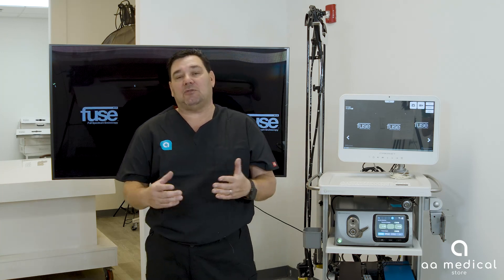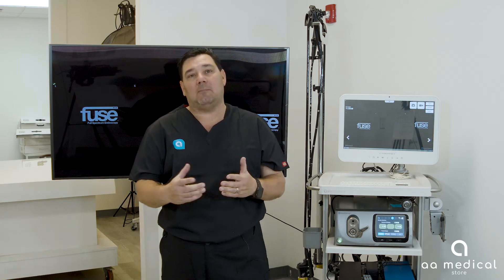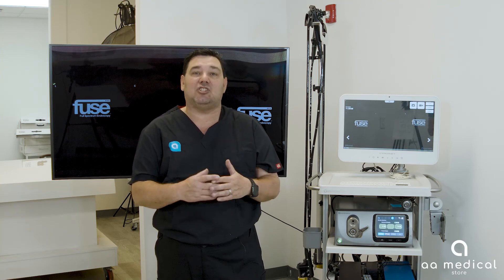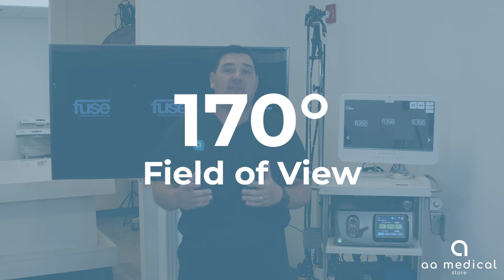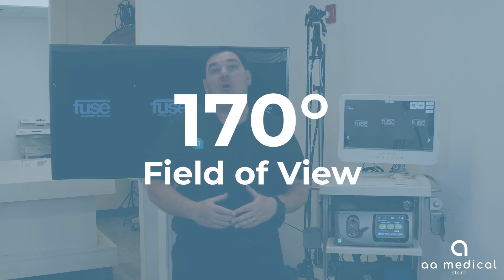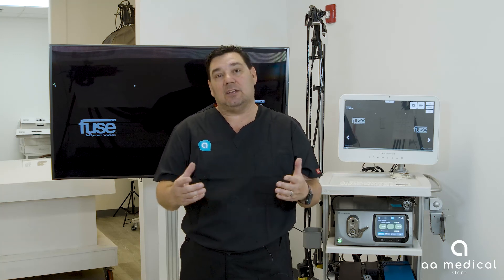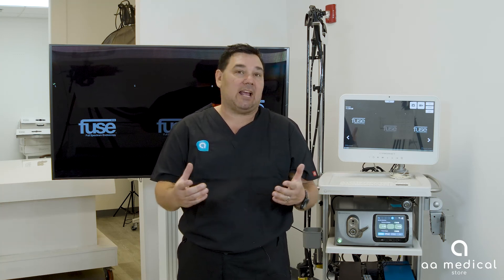The EndoChoice Fuse system is a full spectrum endoscopy system. What I mean by that is a typical field of view for a colonoscopy or endoscopic GI procedure is about 170 degrees. With the EndoChoice system it allows you to have a 330 degree field of view, which enables doctors to see more anatomy and detect abnormalities within the colon or the stomach for a gastroscope.